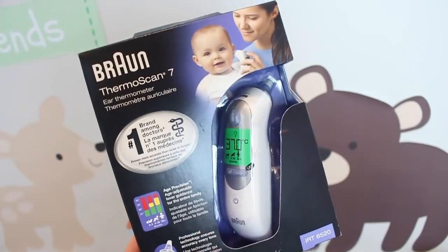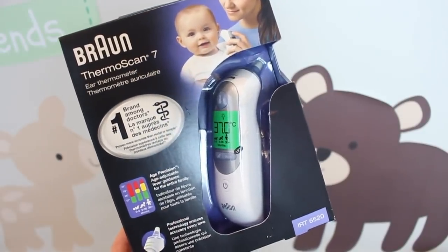Hi guys and welcome back to my YouTube channel. You might hear something in the background — that's my little baby Henry, because we are filming together. In this video I'm going to be reviewing one of our newborn essentials, which is a thermometer, and if you stay tuned until the end I'll tell you about how you can win one of your own as well.